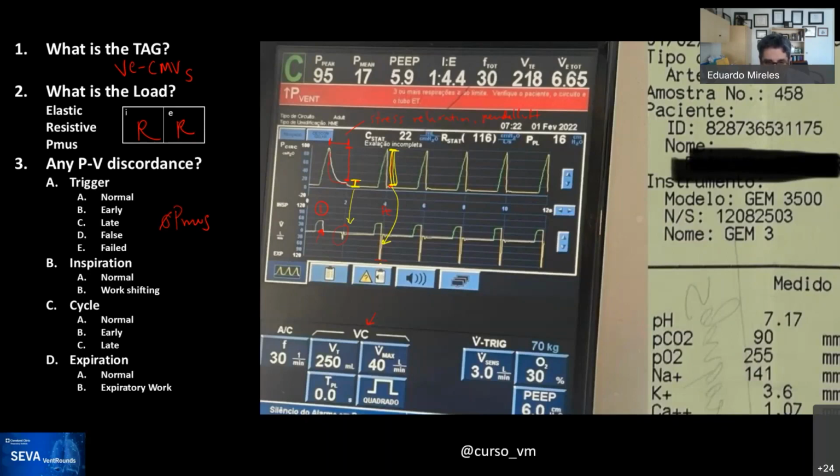That makes sense if the driving pressure for that is airway pressure minus PEEP, because that's coming from the circuit and the proximal airways. If we are talking about driving pressure from the lung parenchyma, then it should be plateau minus PEEP, which probably is the second time constant.